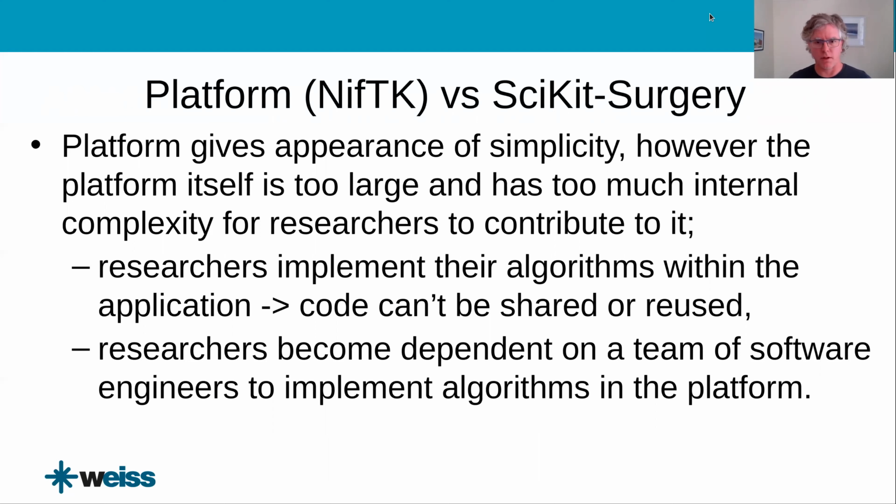So Smart Liver suddenly goes from 3,500 lines of code up to 10,000 lines. It's got all this code that can no longer be shared or reused by other researchers. The alternative is you get a team of software engineers to implement algorithms in the platform, but this obviously relies on having massive resources in terms of software engineers, which most research groups just do not have. It's something you might have as a private company, but not as academic researchers.